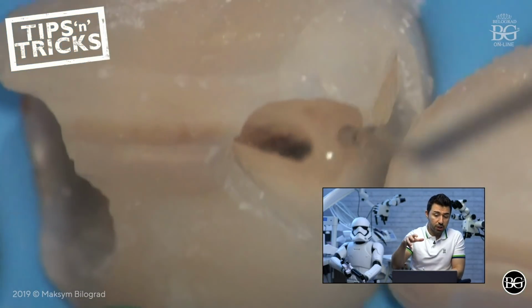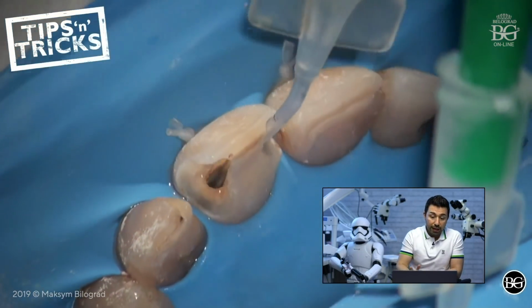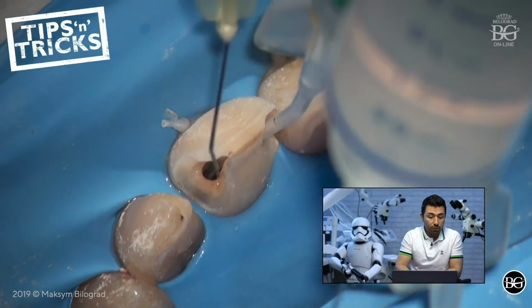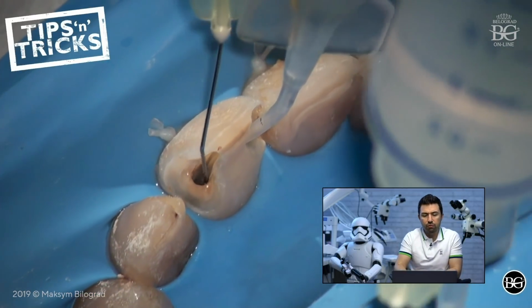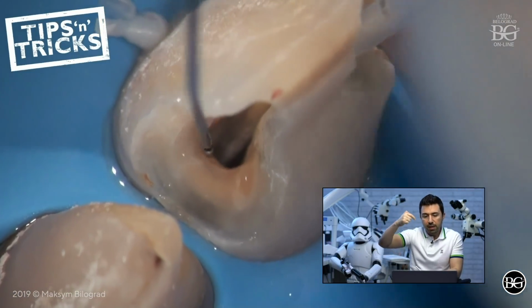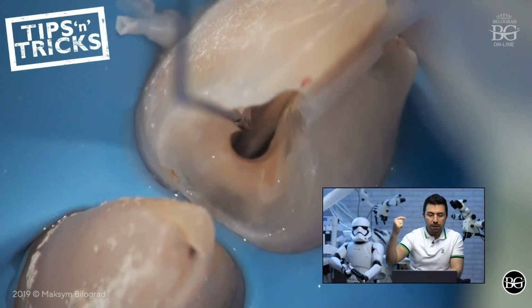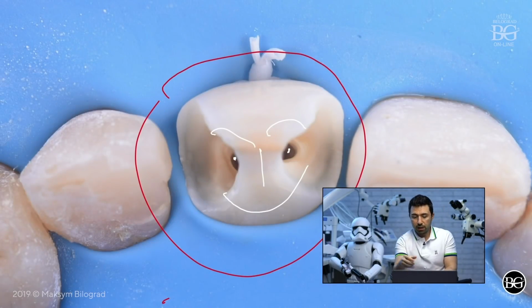I would put this calcium hydroxide needle, like you can see now. This calcium hydroxide needle is in the root canal, in the apical third, at working length actually, and I'm just injecting my sodium hypochlorite from the orifice, and all this irrigant goes to the apical third. We get some hydrodynamics, there is no risk of overextrusion, and everybody is happy. And the good thing also is you are doing stressless dentistry.